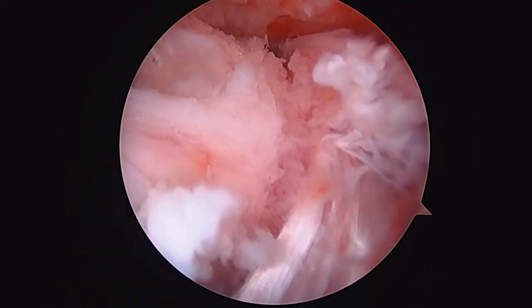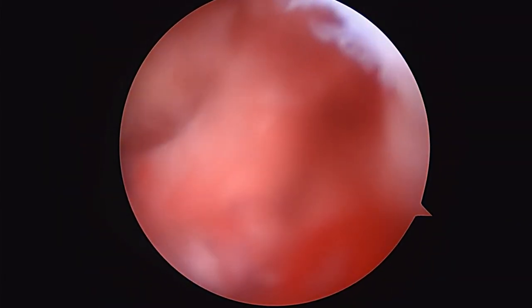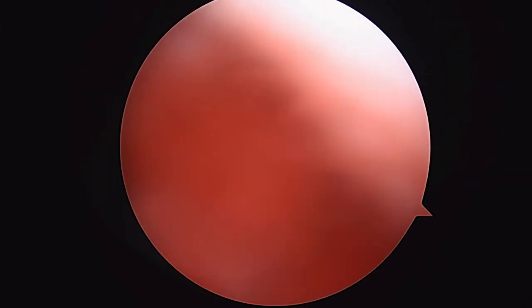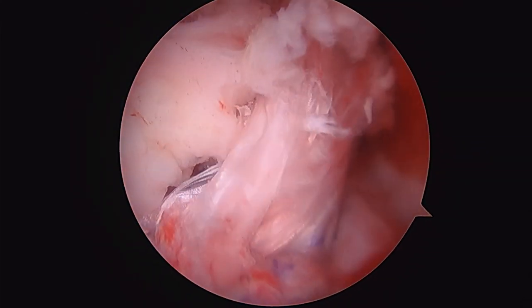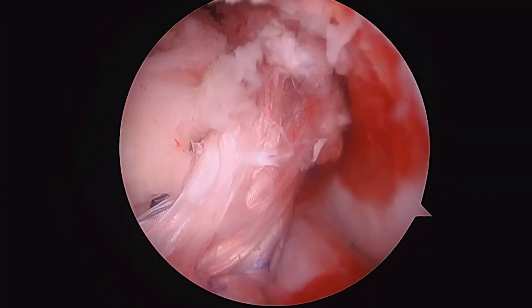We're done fixing it on the tibial side. As we tense the knee, we can see the graft has good tension as we come into extension. As we straighten the knee, that graft tucks back nicely. Give me a little bit of a drawer — anterior drawer this time — we're going to look at the knee and see what it looks like.